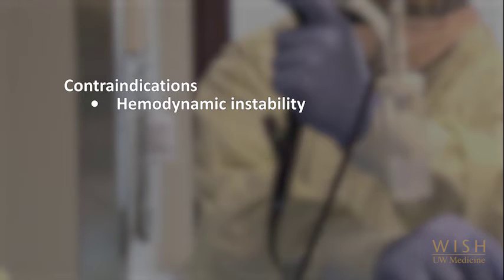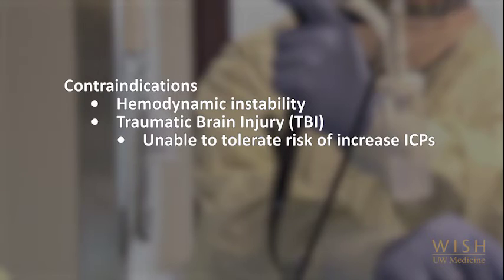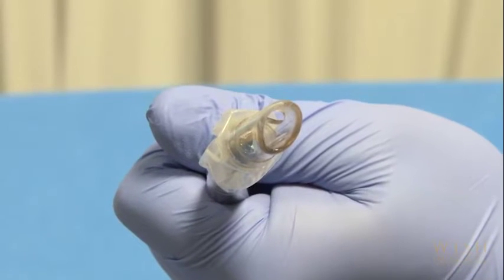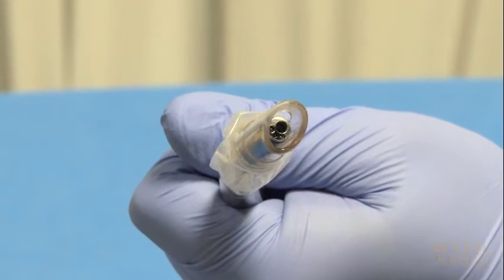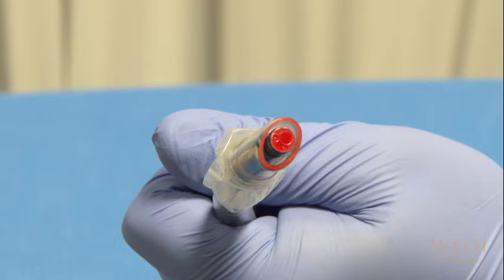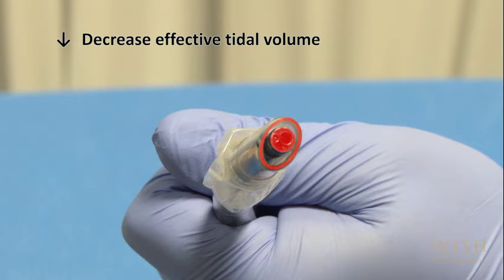Patients with hemodynamic instability, or those who cannot tolerate increased intracranial pressures, should not have bronchoscopy performed. Likewise, patients who have life-threatening respiratory failure and cannot tolerate any degree of worsening hypoxia or hypercarbia also should not undergo BAL. Inserting the bronchoscope into the endotracheal tube will cause a dramatic decrease in the effective diameter of the endotracheal tube.